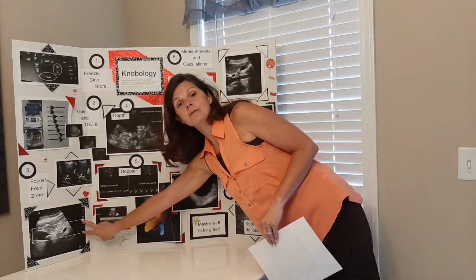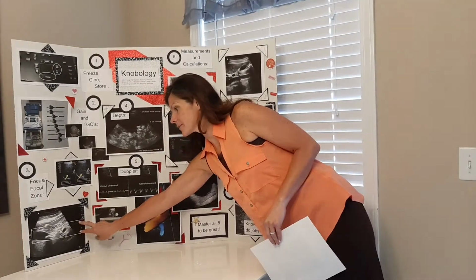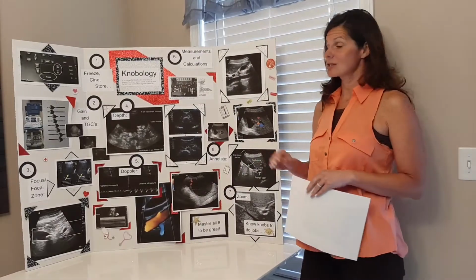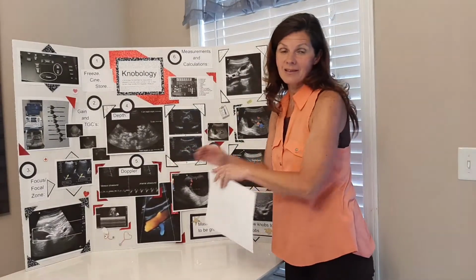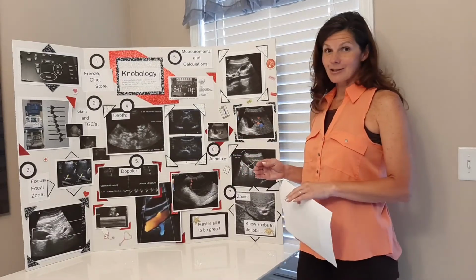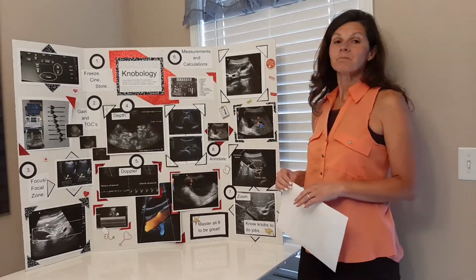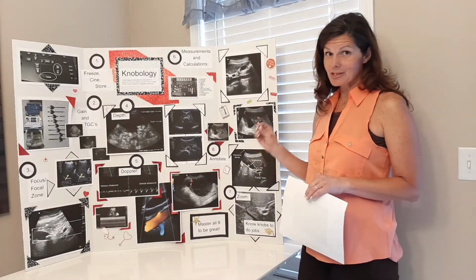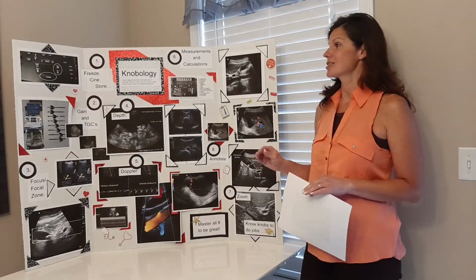We've got two focal arrows placed here, and that's our focal zone. So we're drawing the radiologist's attention to this area and saying, hey, look at this pathology that we have right here. By the gallbladder, we've got a stone right near the neck. So focus and focal zone are very important to draw the radiologist's attention to that area.